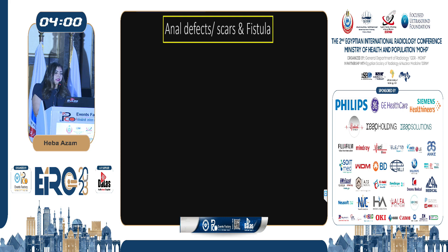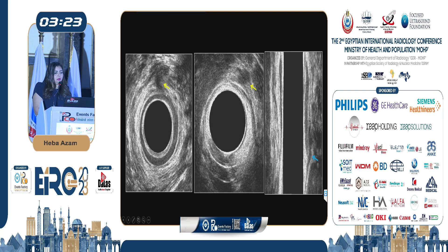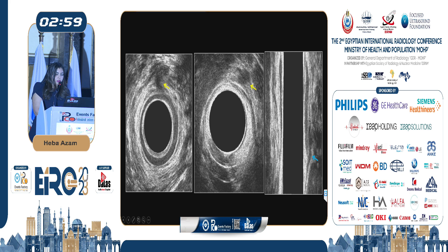Endoanal ultrasound allows us to identify anal defects, scars, and fistulae. In this case, the internal anal sphincter's hypoechoic ring is interrupted from 1 o'clock to 6 o'clock, and there is a hypoechoic collection in the intersphincteric space extending to the external anal sphincter, representing a defect in the internal anal sphincter and a fistula tract. In another case, the internal anal sphincter is shown as a continuous hypoechoic ring with no interruption, yet in the external anal sphincter a hypoechoic collection is seen at 12 and 1 o'clock; on coronal reconstruction, a fistula tract is visible in the intersphincteric space breaching the external anal sphincter and extending beyond it.